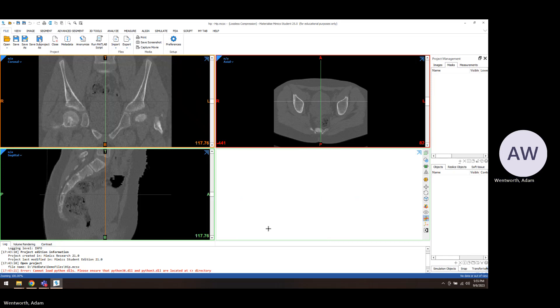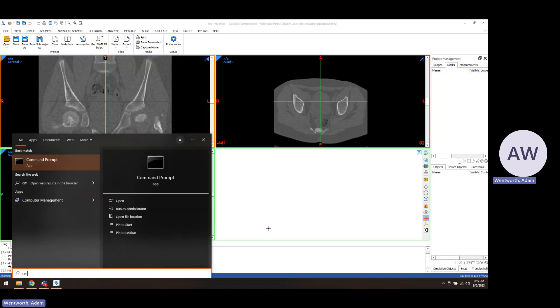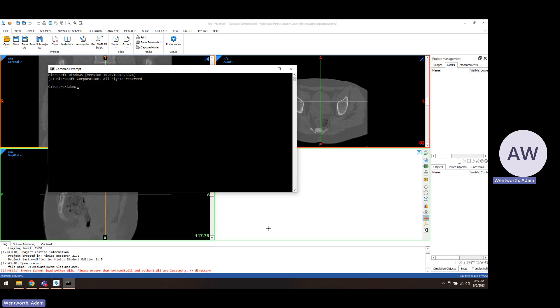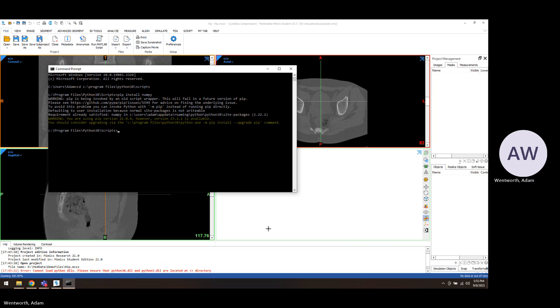If you require installing any Python packages on Windows, you have to open the command prompt and then navigate to that folder. So you do cd c colon forward slash program files, Python 3.8 forward slash scripts. This is just the default path. Then you would write pip install and then the package name. The packages that we would use are numpy. If it's already installed, you'll get this message. That's how you would run the basic install of Python and add any packages that you need in your code.